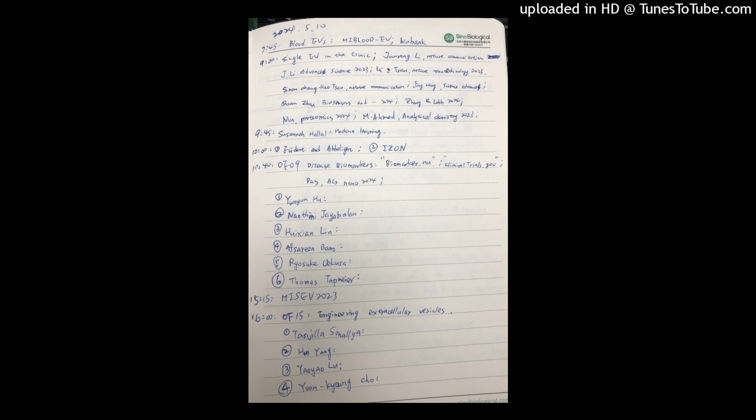Yeah, I agree with you, but again, the point is every hospital, every biobank has different equipment and different operators. And what we see is that even if you give a very detailed protocol to different institutes and experienced labs, we still have plasma that is not comparable regarding the composition.